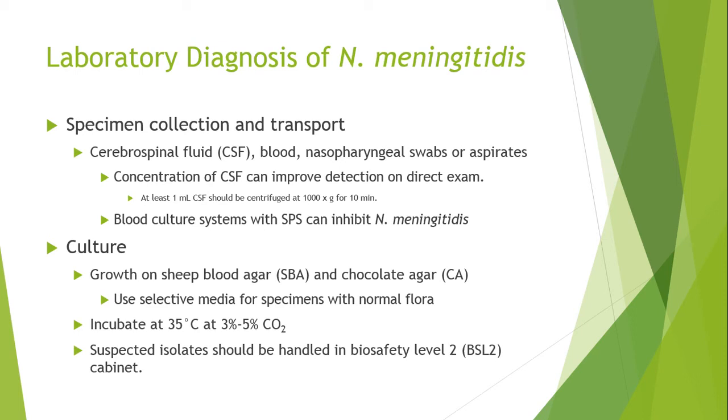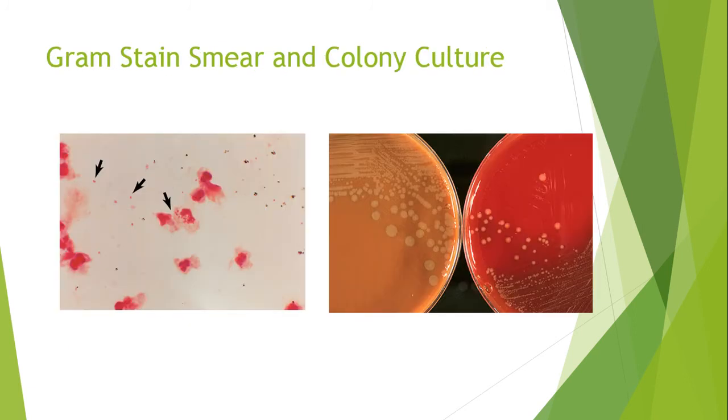Incubate at 35 in a capnophilic environment. And then this is a BSL-2. You want to work under the hood with it because it's highly transmissible and fatal. So here it is, gram-negative cocci, and here it is growing on both the sheep blood and the chocolate agar.